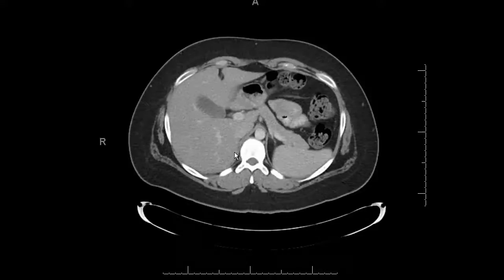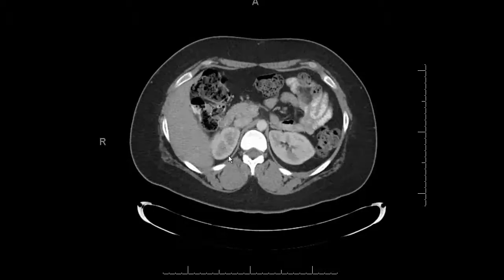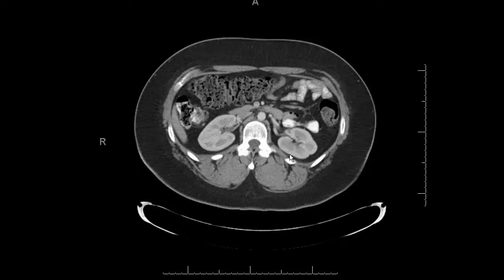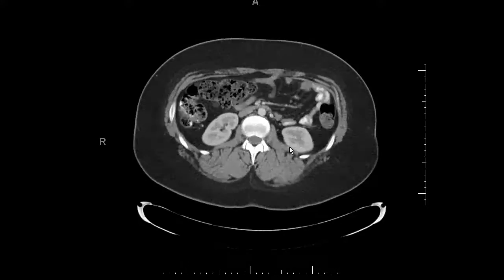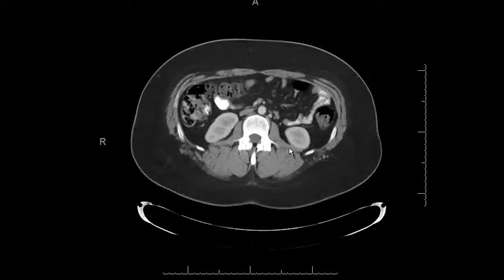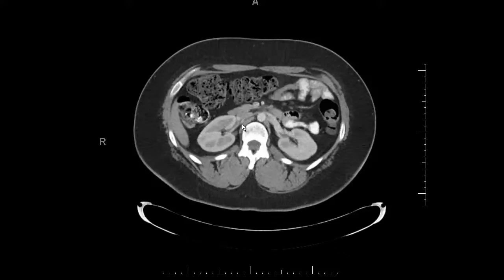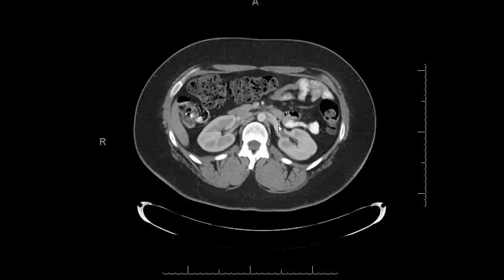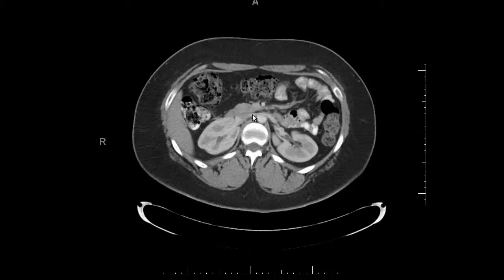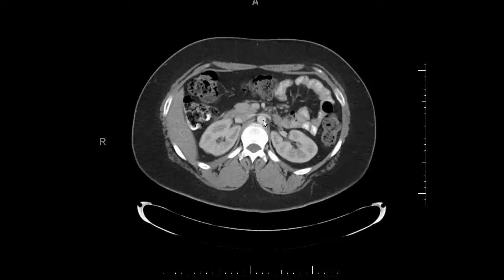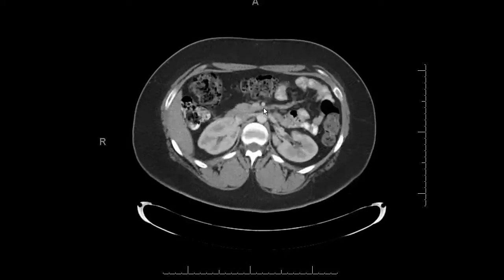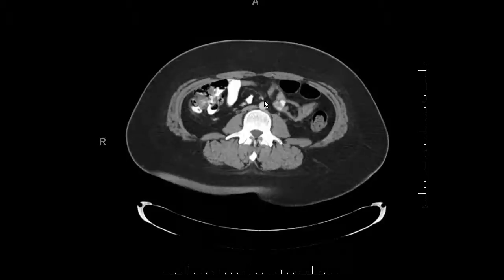Then I look at the adrenal glands on either side — just go to the top of the kidney and scroll up. For both kidneys, I check if they're symmetric, if they enhance symmetrically, if the size and shape are normal, making sure they're not malpositioned, and looking for masses. Then look for the renal arteries and renal veins — you can see vessels coming out from the hilum, follow the veins to the IVC and the arteries to the aorta.